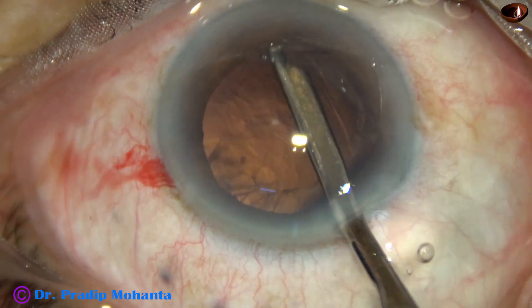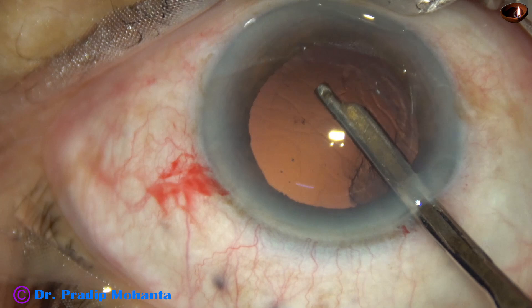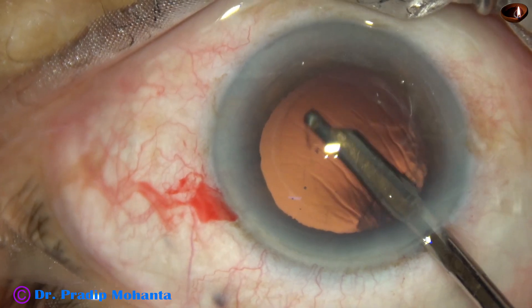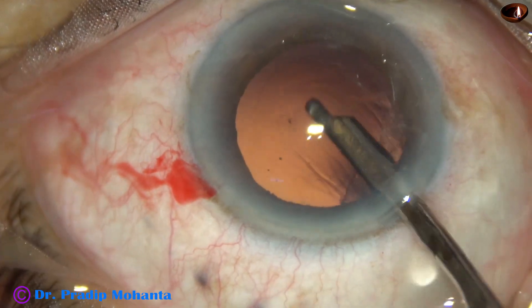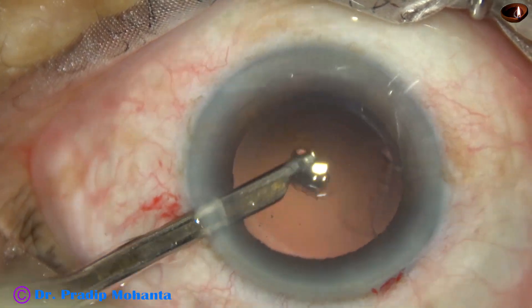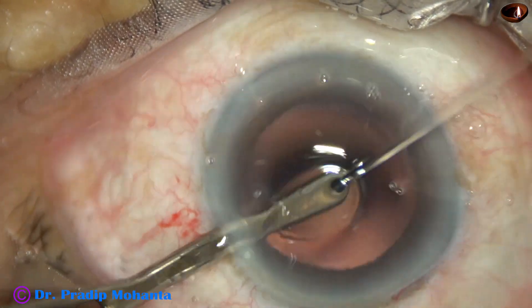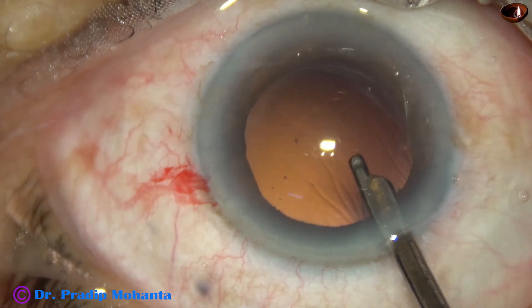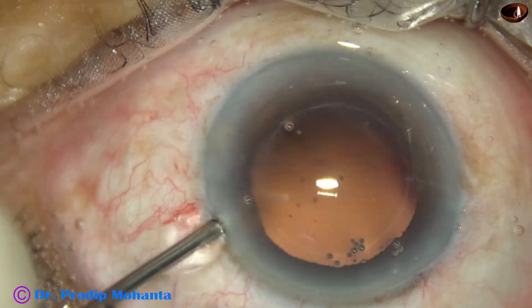Cortical clean-up is done, in this case with the help of a Simcoe cannula — whatever you like, you can use. This is a coaxial IA; you can use bimanual irrigation aspiration, in which case you will need another side port on the right side. I go through the side port, which is about 1.6 to 1.7 millimeters, and the 23 gauge Simcoe can remove all the cortex. If the side port is small, we can use bimanual irrigation aspiration — irrigation through the main wound and aspiration through the side port.